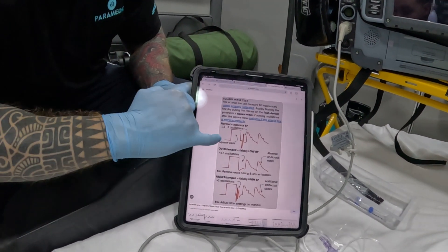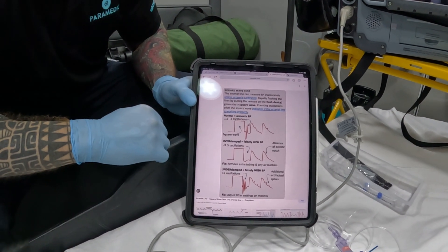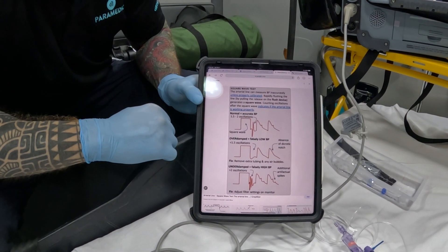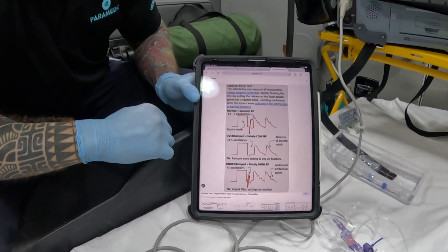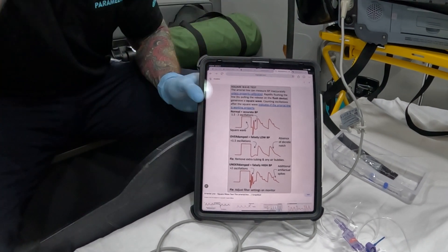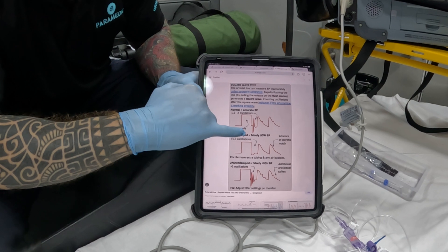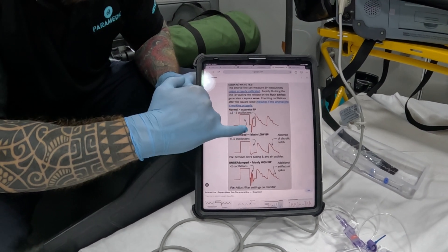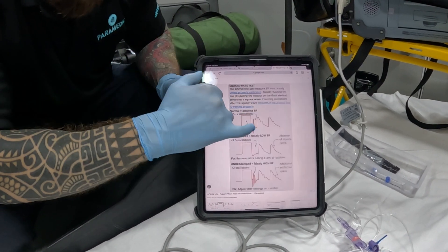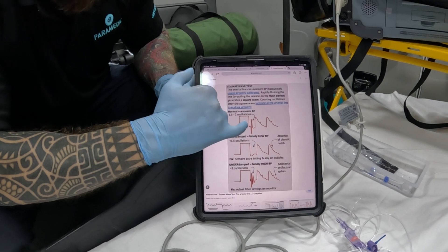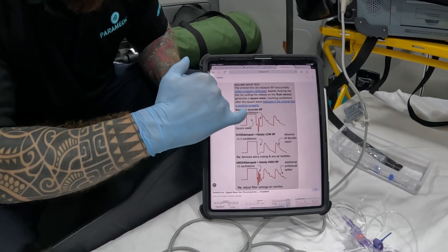Why is it called a square wave? Because you're creating a square. If the system is properly dampened — meaning the fluid is correctly pressurized to 300 mmHg and everything is set up right — you should see between 1.5 to 2 oscillations. It goes up and down and then returns to the arterial waveform, meaning your system is accurately set up.